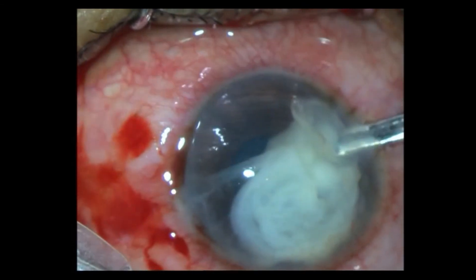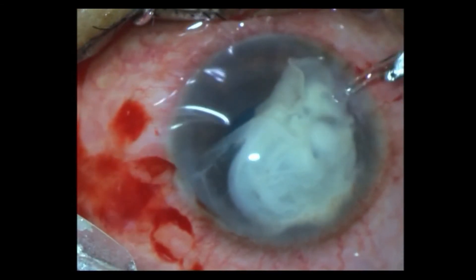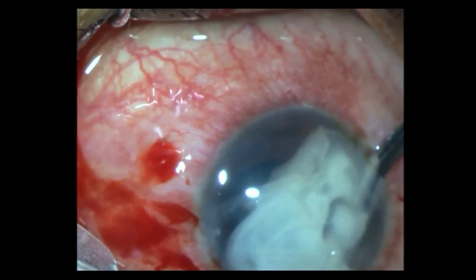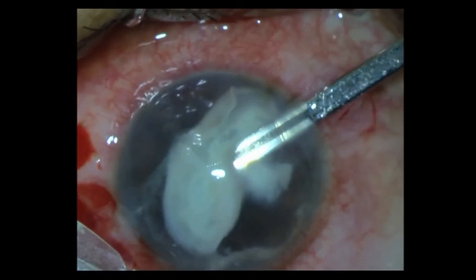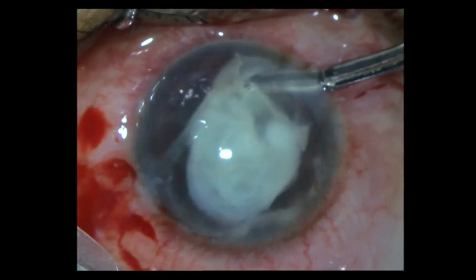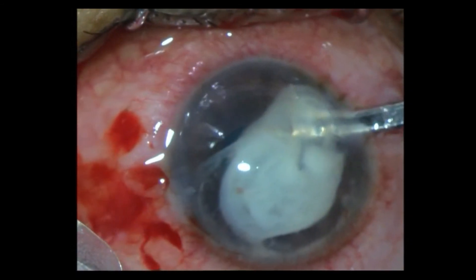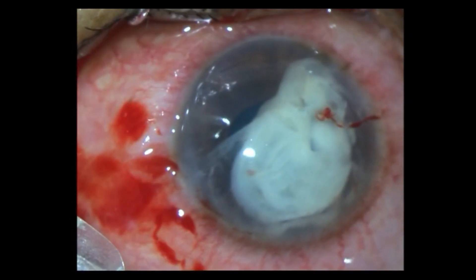Underneath you can see how clear the iris details and the lens are. So now I have to detach all these attachments and pull out this organized mass. It's not easy. Trying from the other side as well.